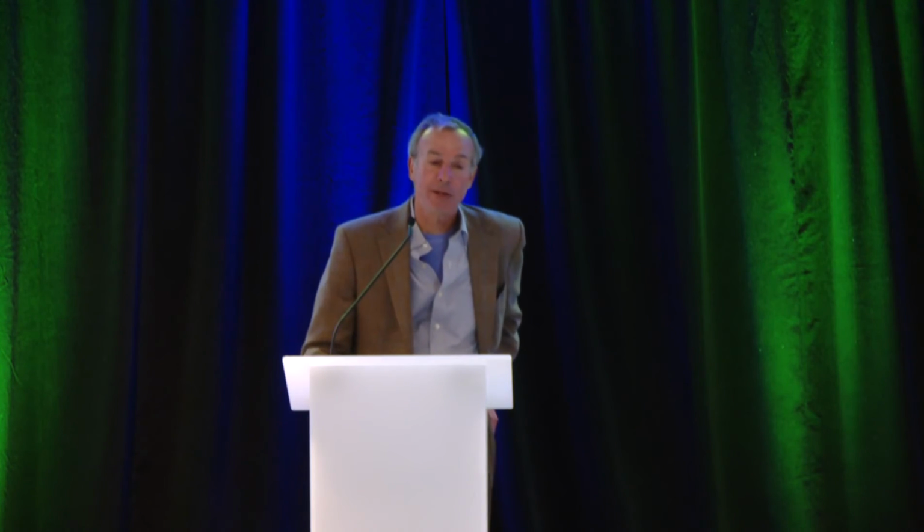And the key innovation that revolutionized manometry was applying tactile array nanotechnology to HRM devices. What you're looking at here is that mat that the lady is lying on actually has a multitude of pressure sensors in it, so it kind of detects all the pressure points on her body. And the technology that allows that to happen is shown on the right over there, where each of those little dots is independently detecting pressure, and they can be embedded onto these tiny little microchips. So basically, you have almost an infinite ability to record pressure in any level of detail that you need.